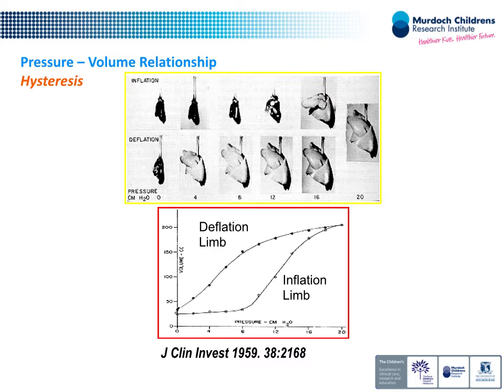And the pressure that actually causes the lung to collapse is much lower than the pressure we needed to get the lung to inflate. And this is something we could adapt and utilise at the bedside. So this is the closing pressure of the lung. The closing pressure of the lung here is 4, the opening pressure was 16. And again, you can see this concept of hysteresis. For any pressure you apply, there are a series of lung volumes you can achieve. It's incumbent on us to find the right volume for the pressure that we want, and therefore the right pressure that gives the right volume.